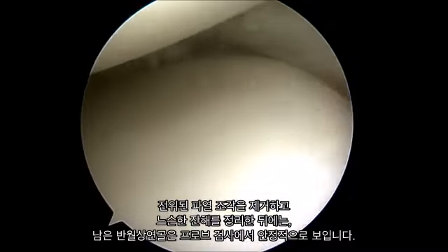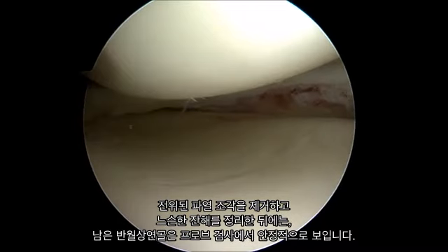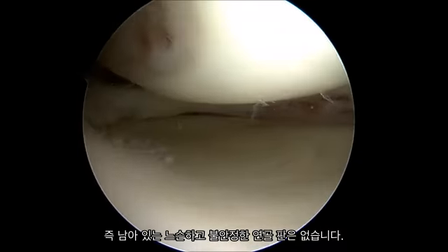After the displaced bucket handle fragment has been removed and the loose debris is cleaned up, the remainder of the meniscus is stable to probing with no residual loose, unstable flaps of tissue.